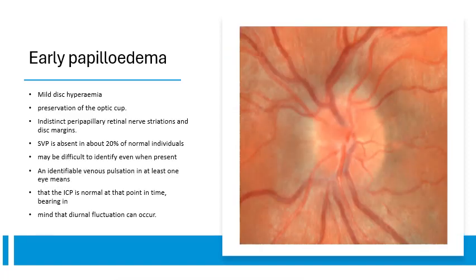One of the very commonly seen conditions by other specialties is the papilledema. Papilledema means that there is a rise of the intracranial pressure, which is reflected through the CSF and gives edema of the optic disc of both eyes. In early papilledema, we will find what we call hyperemic disc edema. So there is an increased hyperemia of the surface of the disc, and the optic cup may be preserved or lost, may be preserved in very early papilledema.